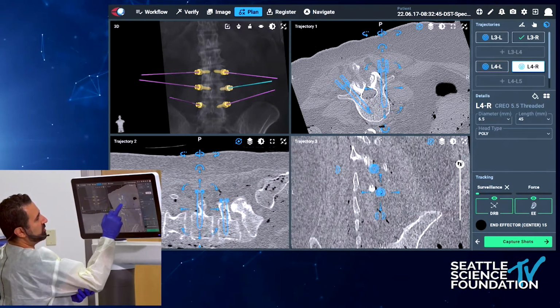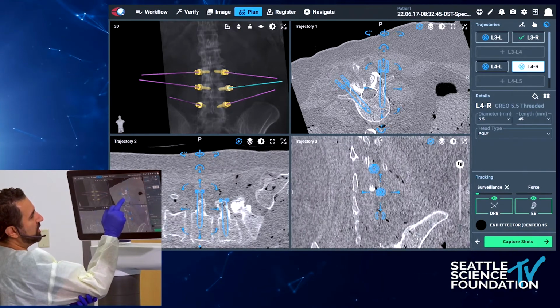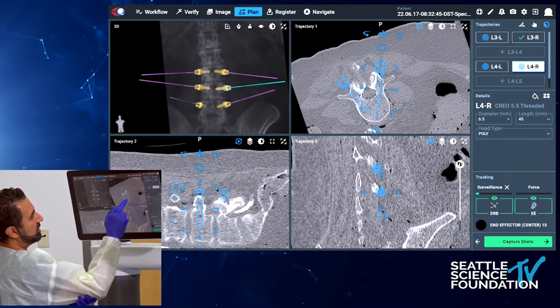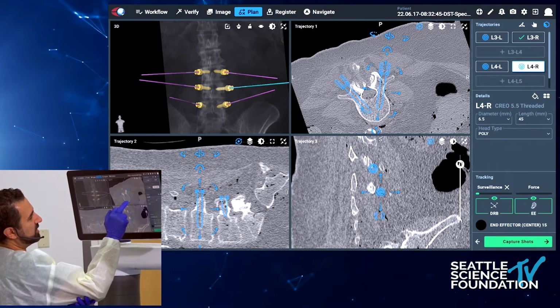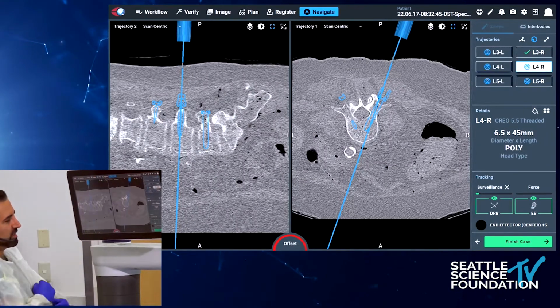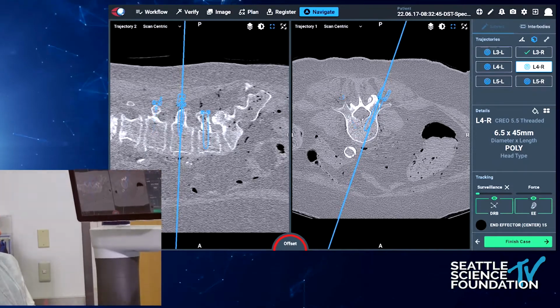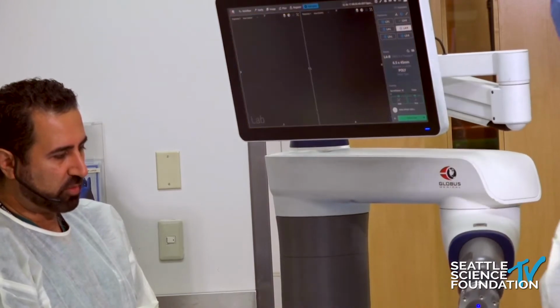It's a simple change for me to make an alteration of the instrumentation. So I'm able to easily make that correction. And then you can kind of see it. Here we are. This is my ideal projection. I'm seating it in my ideal spot. Now, this is an easy cadaver because their anatomy has read the textbook. But if that wasn't the case, all I need to do is just reapply my pedal, if you like, and you look at the micro motions that are present there.